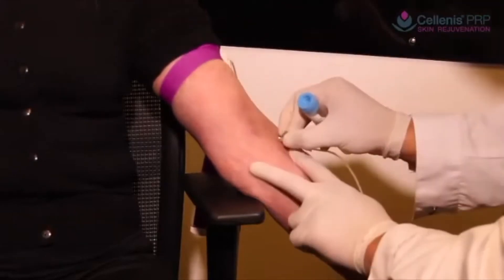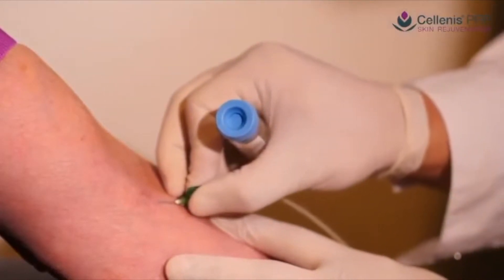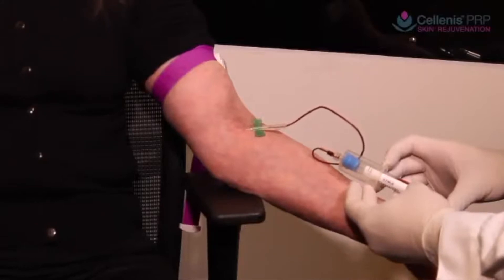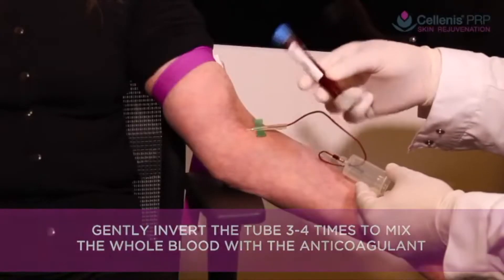Using venipuncture, blood is drawn. The blood draw will stop at the 11ml mark shown on the tube. Ensure the 11ml mark is reached because the correct ratio of blood to anticoagulant in the tube is important. Ensure the anticoagulant is mixed with the blood by inverting the tube 3 to 4 times.